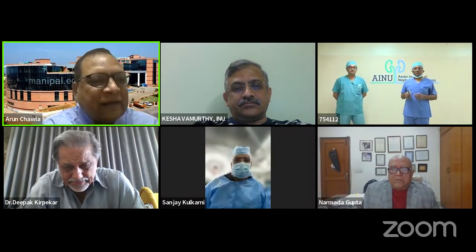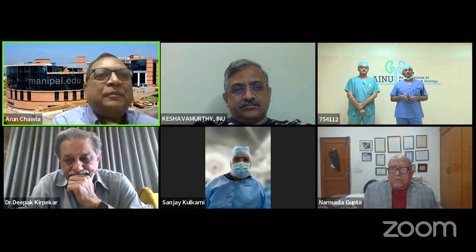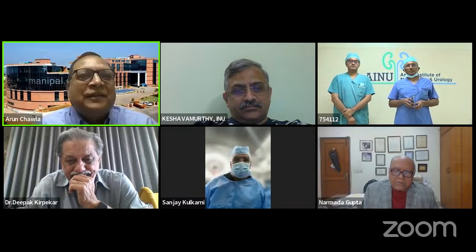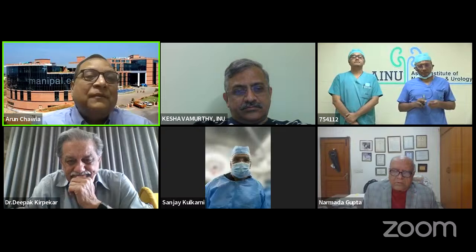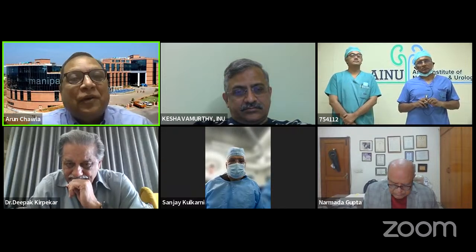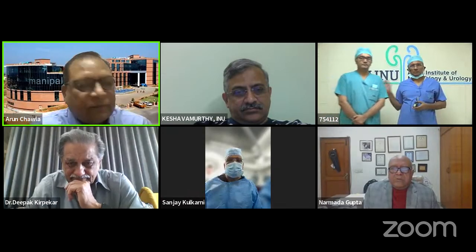We all know that the technique of prostate resection is tailored to the patient factors as well as the anatomy of the prostate. And we also know that this technique varies amongst ourselves. But to learn, we have kept this webcast, which will impart knowledge about the art, which we will see what the masters perform, and the science, which the masters will be talking about when they are performing, as well as the quality comments made by our moderators from their experience.